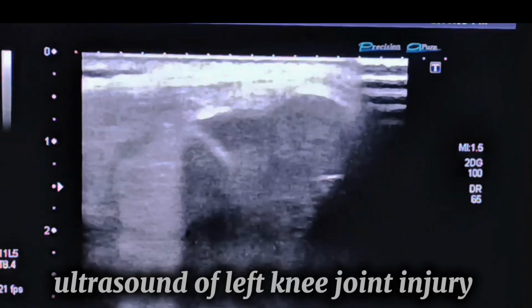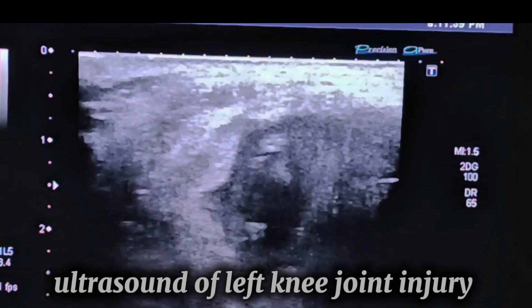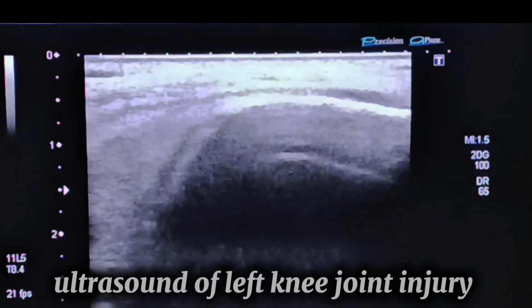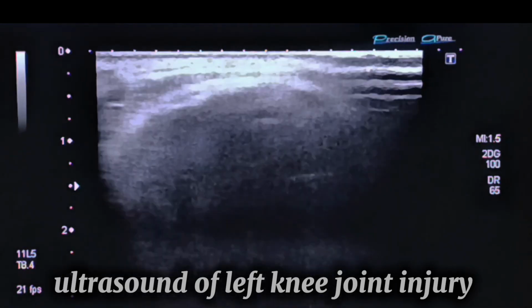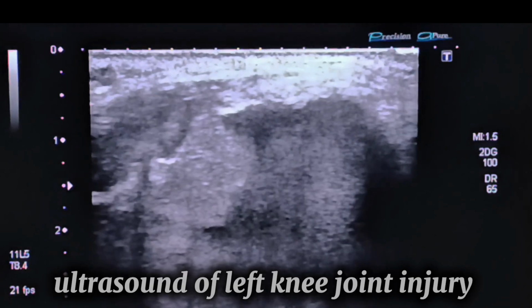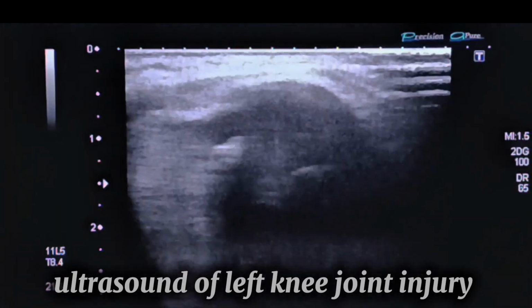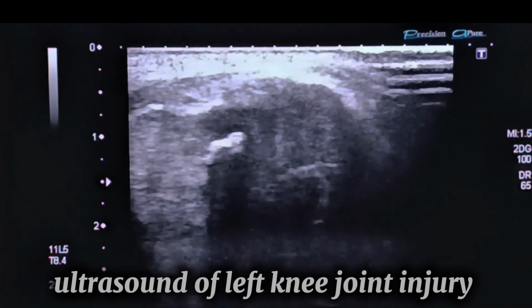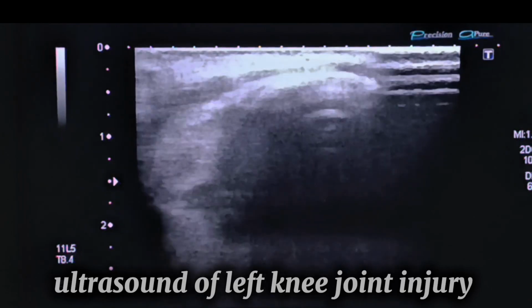Recommendations in this case were referral to orthopedics for evaluation of loose body management, particularly if mechanical symptoms like locking are reported. Consider joint aspiration if symptomatic to exclude infection. Correlation with prior MRI findings and possible follow-up with dynamic ultrasound to assess patellar motion. Clinical monitoring for any increase in swelling, restricted movement, or persistent instability.